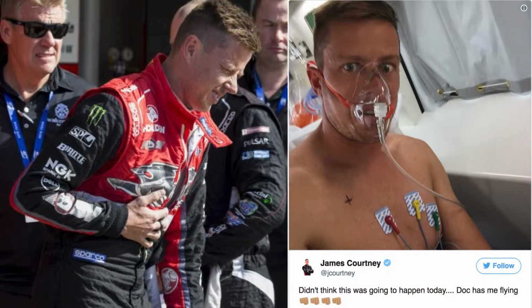Then there's this next group of patients who have stable vital signs but positive findings on physical examination. We already know that patients like this will have an abnormal EFAST, so there's no point doing a scan on these guys either. We treat the patient clinically and arrange for investigations or interventions based on their pattern of injury.